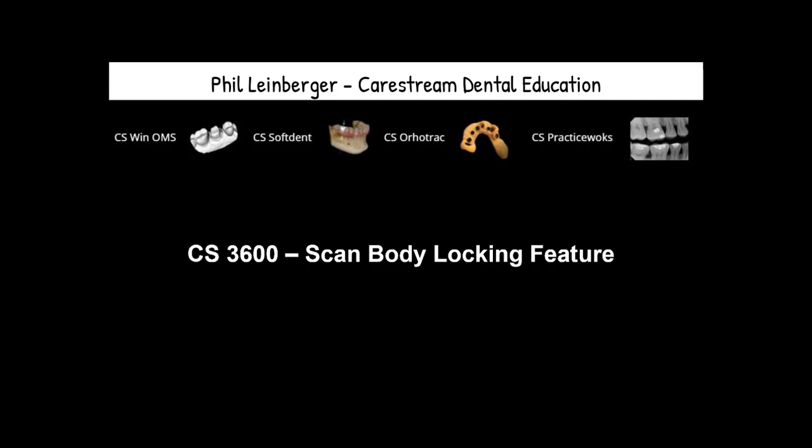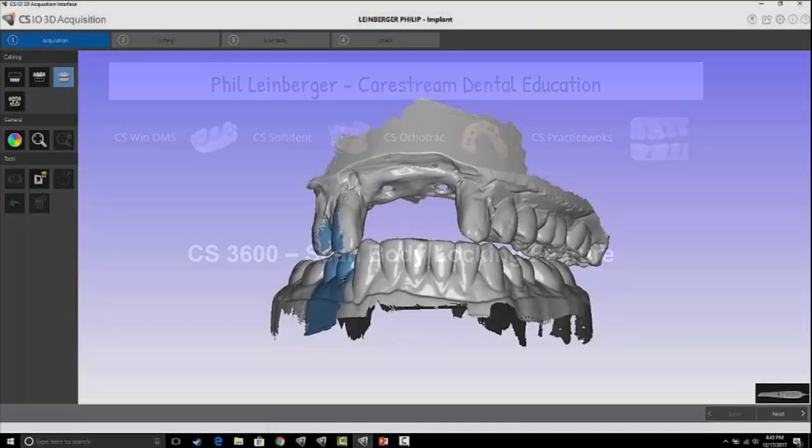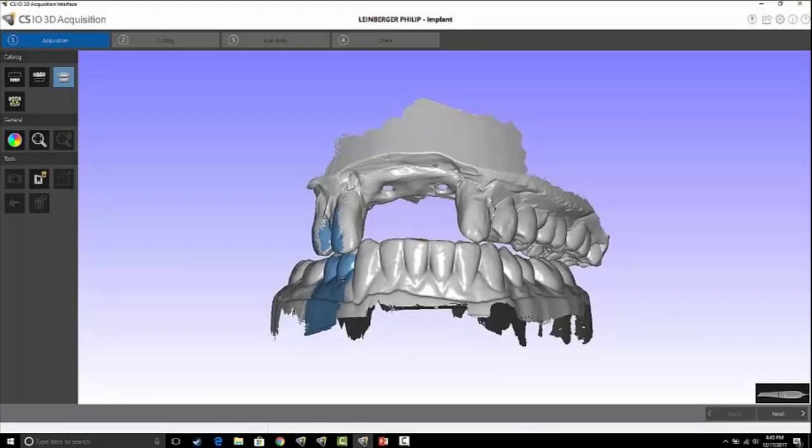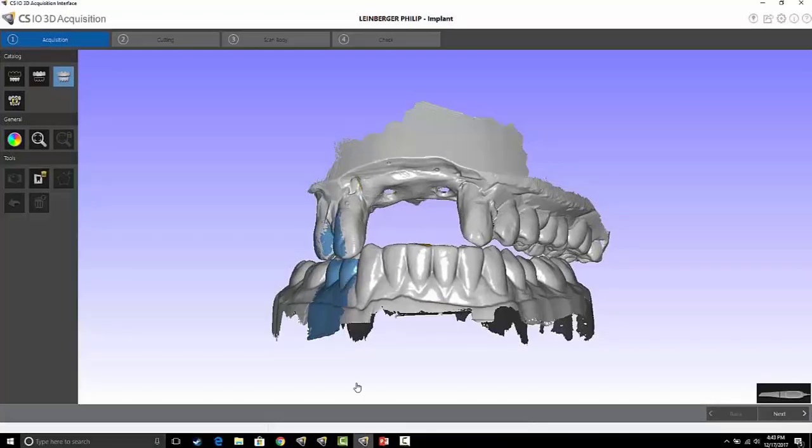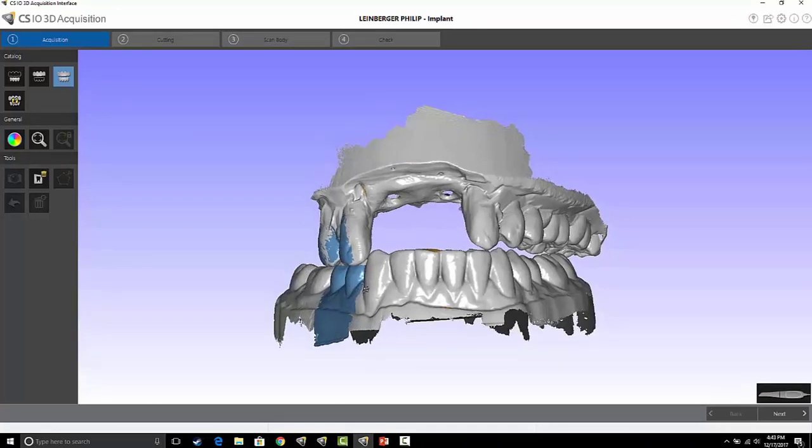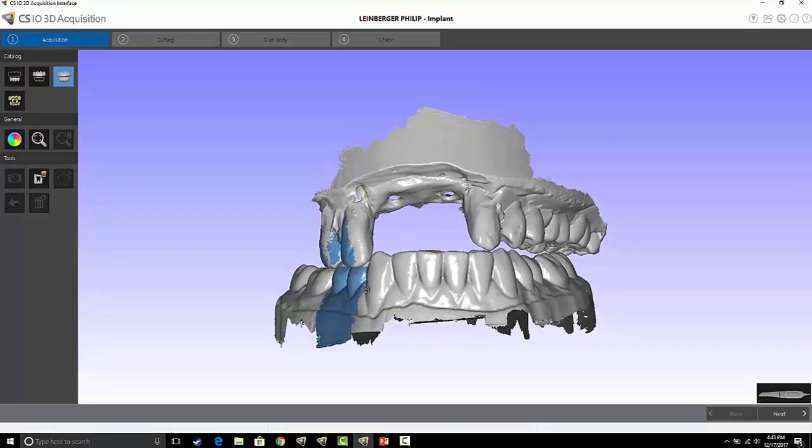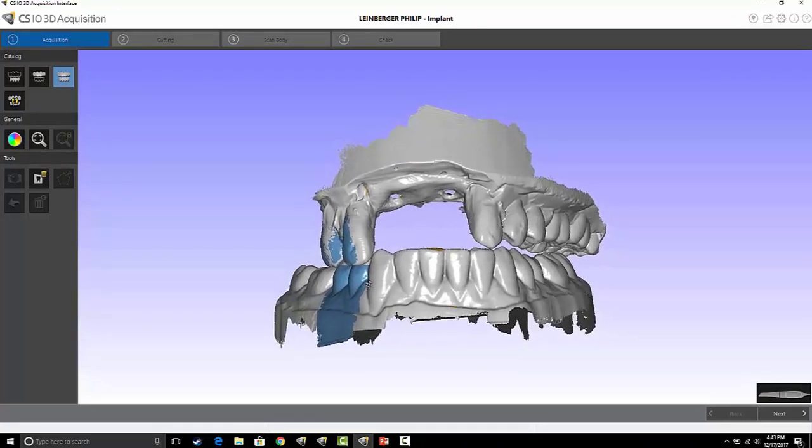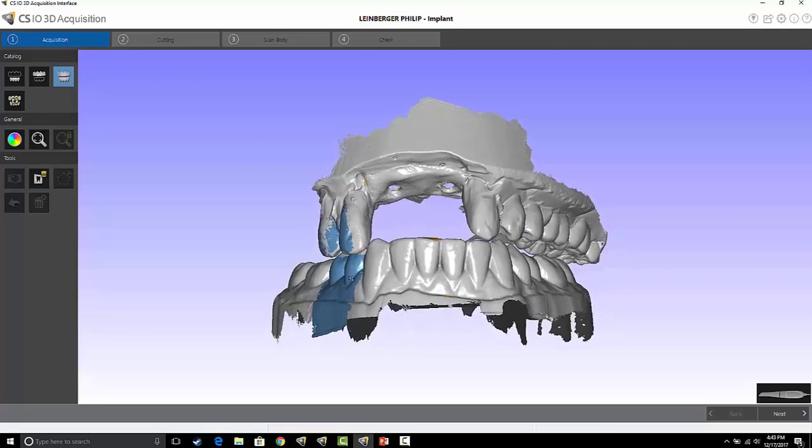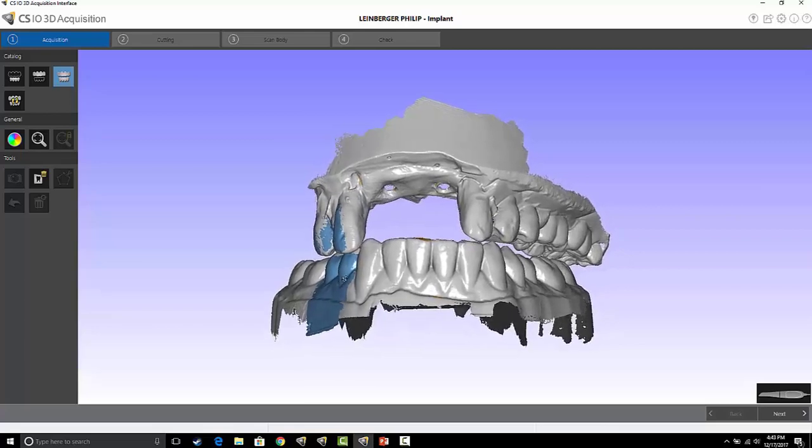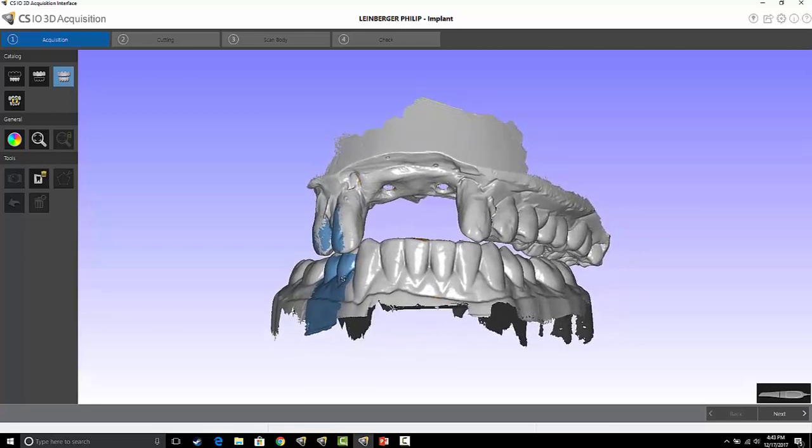This tutorial will cover the scan body locking feature in the version 3 software for the 3600 scanner. If anybody's ever tried to scan multiple scan bodies, they potentially have run into the challenge of having one scan body data added to another scan body because of the similar geometry that they each have. There are multiple techniques you can use to help with this.